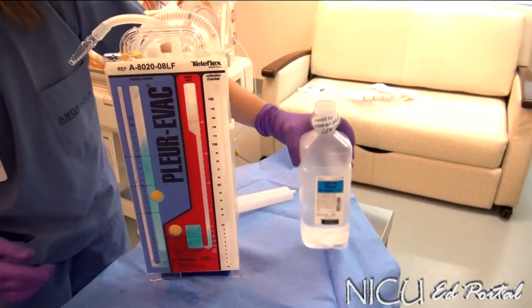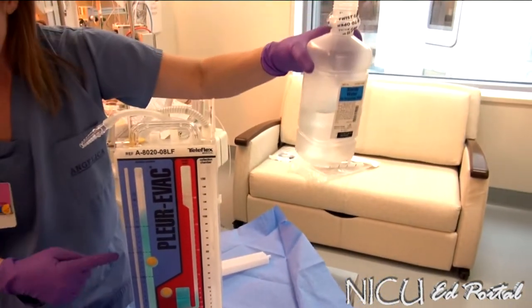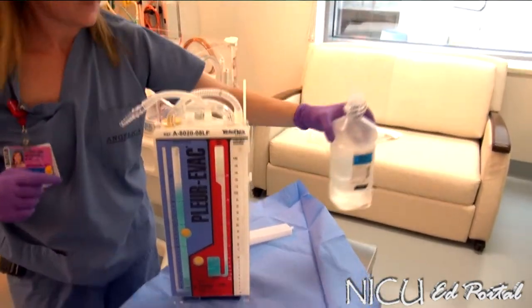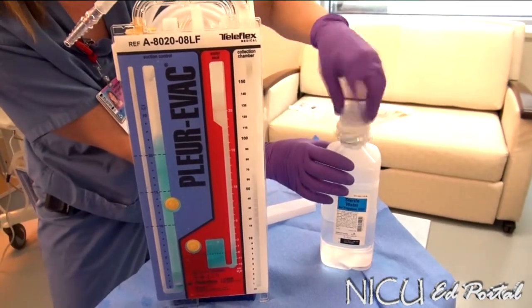Make sure you close your atmospheric vent cap tightly. To note, even though it fills to 20 centimeters of water suction plus the 2 centimeters for the water seal chamber, you've used close to 500mL. So make sure you get a full container of sterile water.